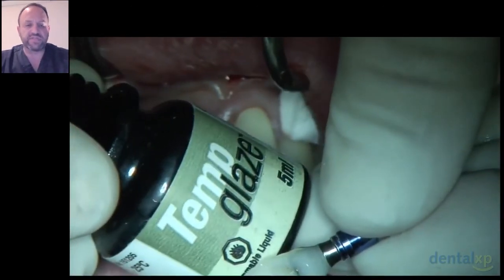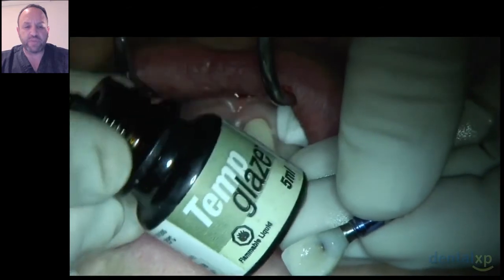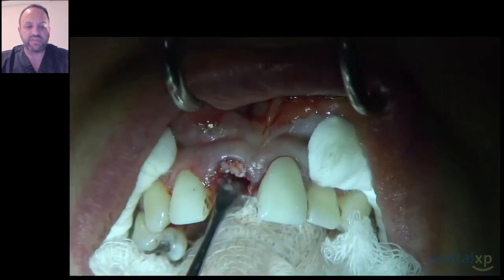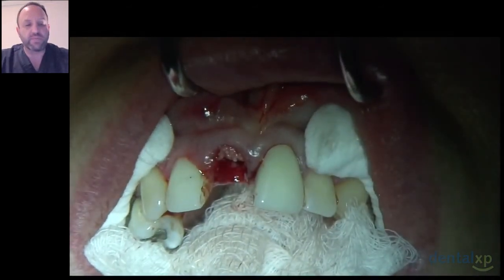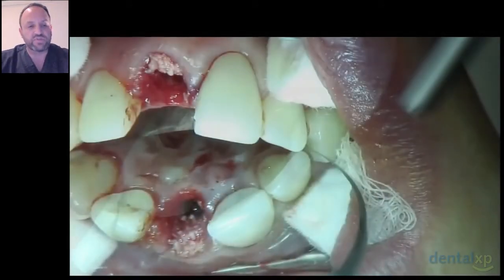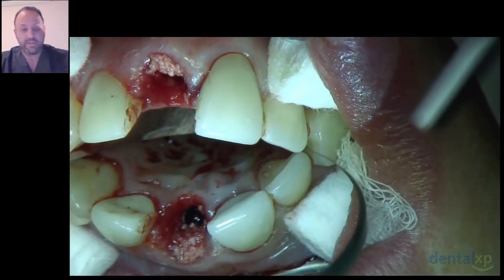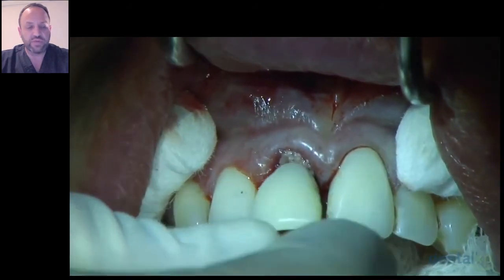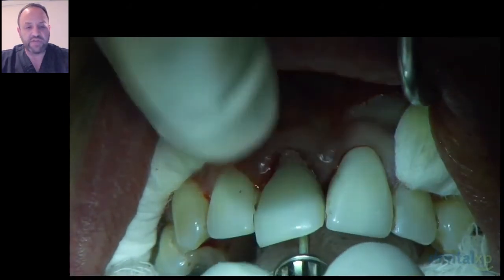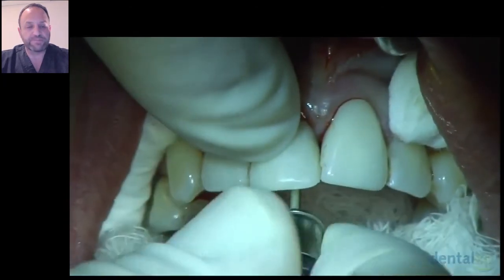This is a product, I think it's available from Ivoclar. And you can then just wipe that off, make sure that there's no excess resin. We then go the dual zone therapy technique and we add a little bit more bone into the top just to support, and that will help to push the soft tissue out. And we then place a little bit of chlorhexidine gel onto the screw so that we have a nice sterile well, and in that gets screwed into position.